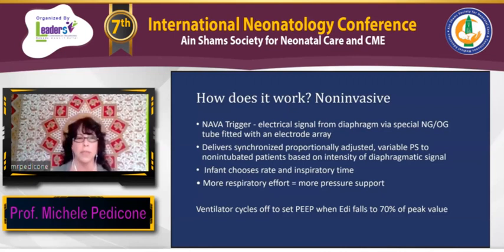And those are important components that we do measure on the ventilator. We will measure our EDI peaks, our EDI mins, our NAVA levels, and we also will look at any time that the patient may go into apnea. As we know, with this patient population, it does happen quite frequently. But with this type of technology, we can monitor how often, when, and maybe do some correlation. Are these patients heading more into apnea during feeding times, or particular medication or care times, or parents handling and the like?